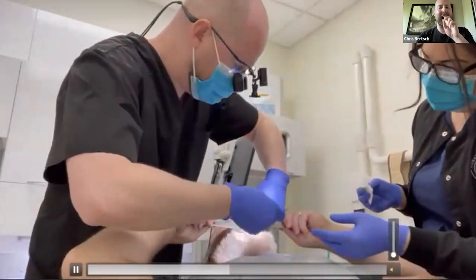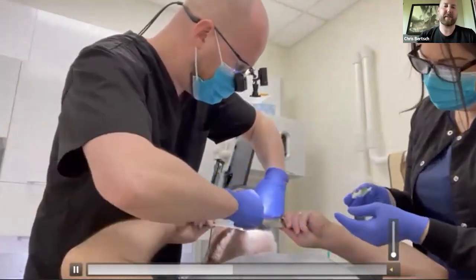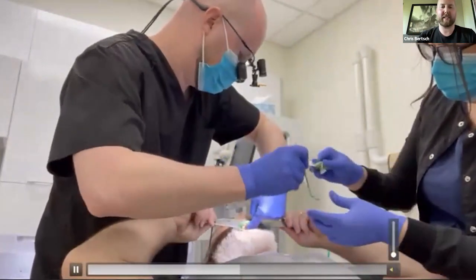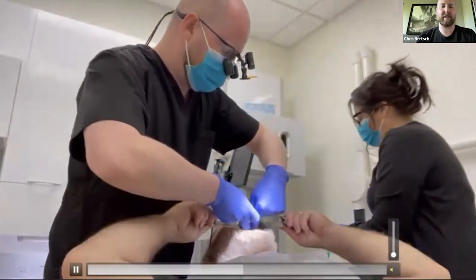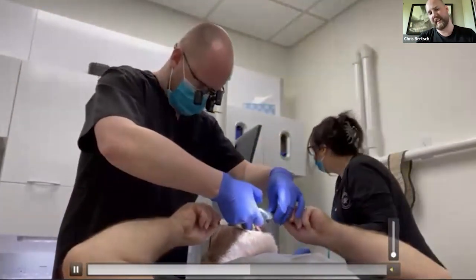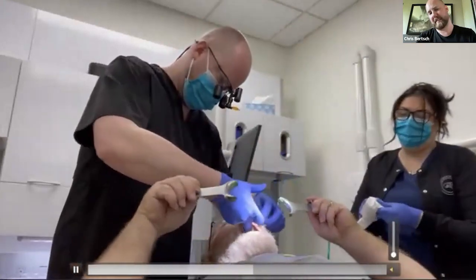I'm always holding it on the palate, and then I scoop at the back of the throat first. And then once that's all clear, we take off those retractors, let the patient just rest at that point. And then we do our border molding movements.